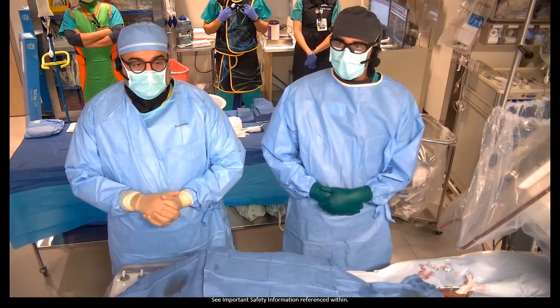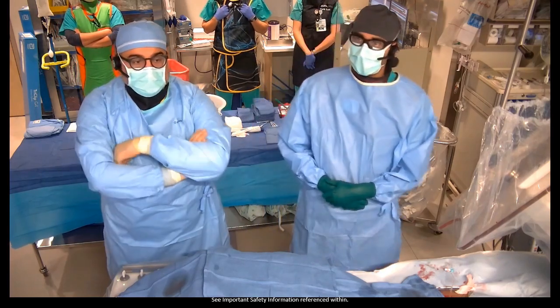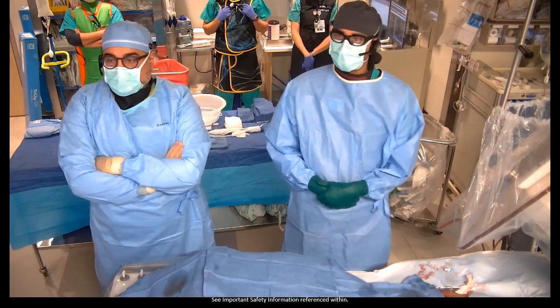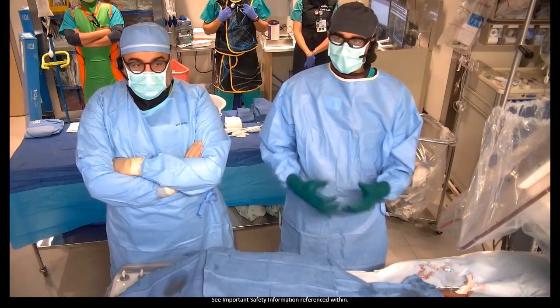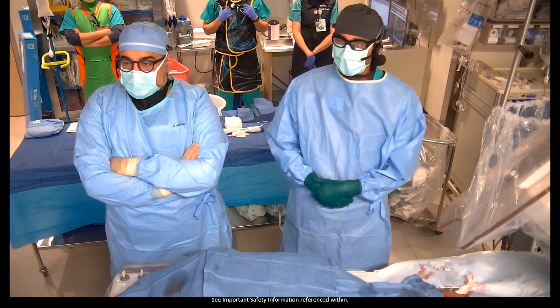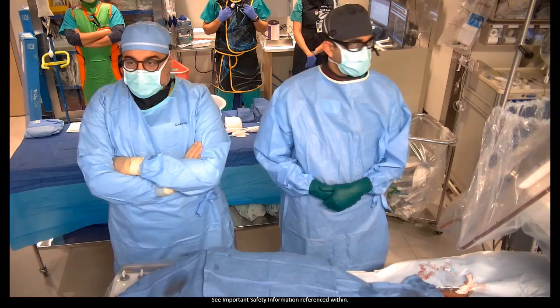And so he was admitted yesterday. We brought him in and did a right heart cath. His filling pressures were mildly elevated, so we diuresed him overnight, used a little bit of milrinone for RV support to augment diuresis, and we brought him here. Now he's on the table, and maybe Dr. Aman will go through some of the echo images.